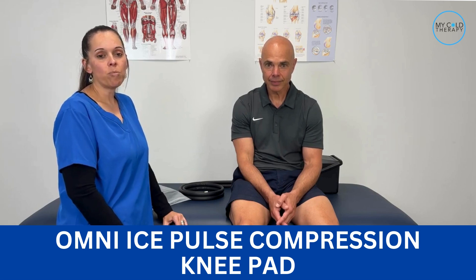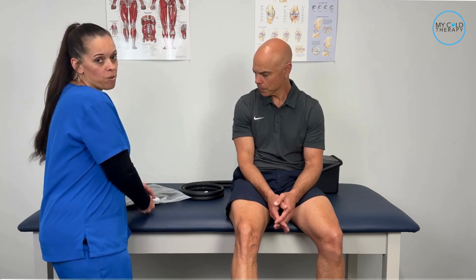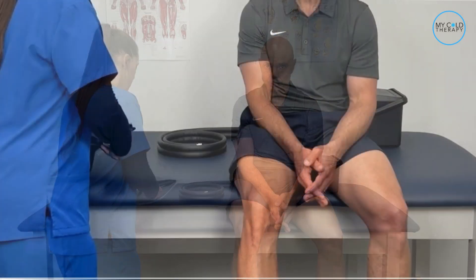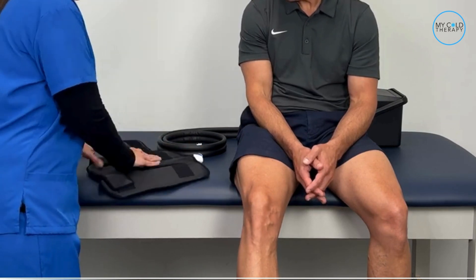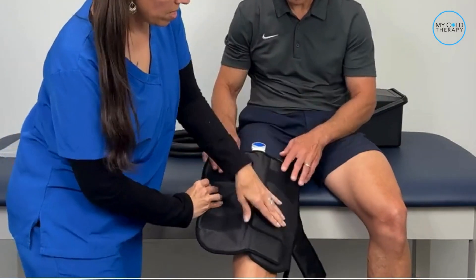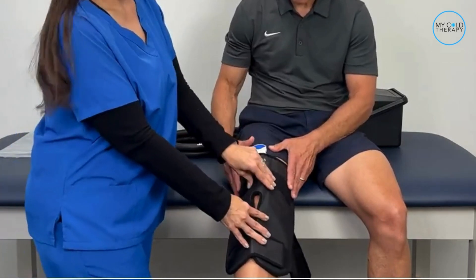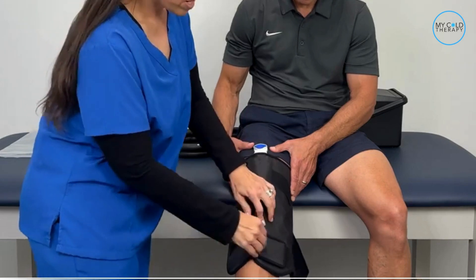Now we're going to show you how to apply the Omni Ice Pulse Compression knee pad. Once you get it, remove it from the resealable bag, then go ahead and loosen up the strut. After that, place it over the knee — you'll notice that the larger part goes towards the thigh with the connector sticking up.